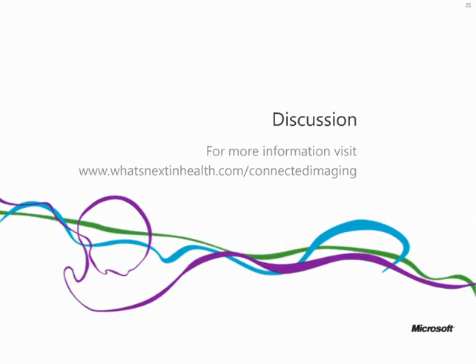And that question is, do your radiologists have contemporaneous access to any clinical information outside the PACS RIS while interpreting? And the answer to that is yes, we do, both at the University of Maryland and at the Baltimore VA Medical Center. For example, on my workstation, I have access to a complete electronic medical record.